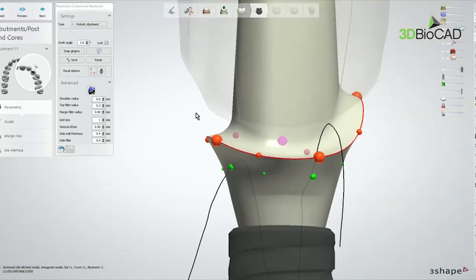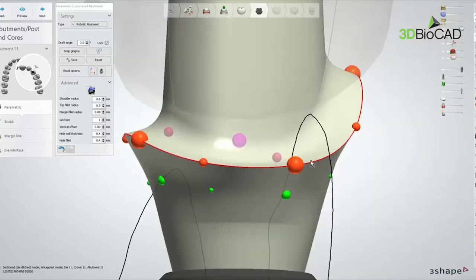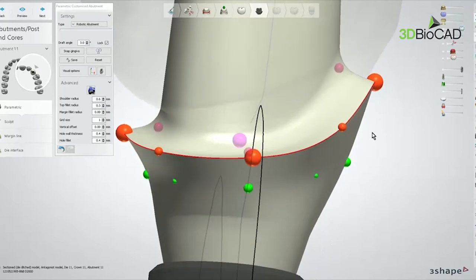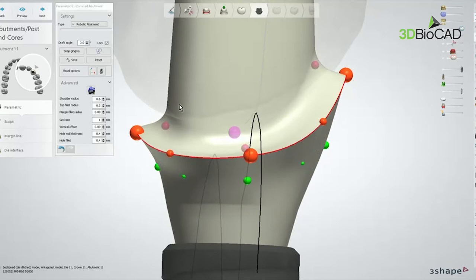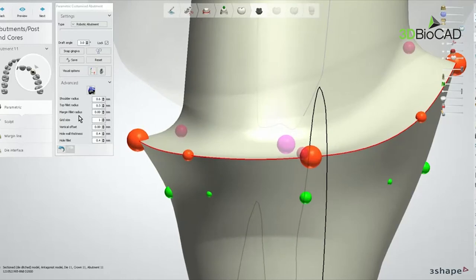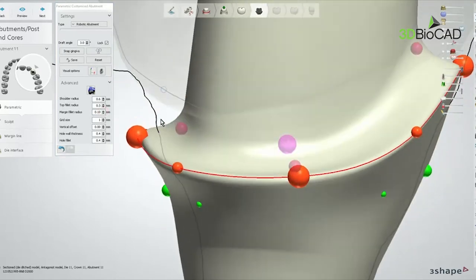I just want to tell you the actual, real story. When you do the design of the abutment, so margin area here. Have you ever had an abutment with a too sharp margin on your custom abutment? We don't want to grind and smooth it again after milling the titanium abutment. So when you design the custom abutment, please use margin fillet radius. Let me click it one time. Second time, can you see the smooth margin here?